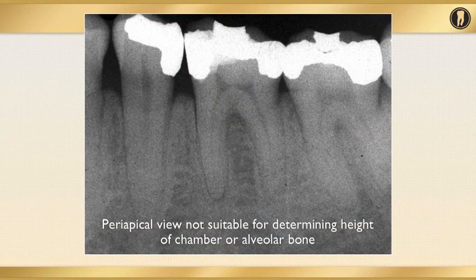If we visually inspect the tooth before we gain access, before we even penetrate the occlusal surface, we know that if we can locate the CEJ, we can determine where the roof of the chamber, our ultimate goal for the initial penetration, will be, without overdoing it or stepping into the more vulnerable furcation areas. This is consistent through all human teeth, maxillary and mandibular, and can be taken into account to try to avoid access errors.